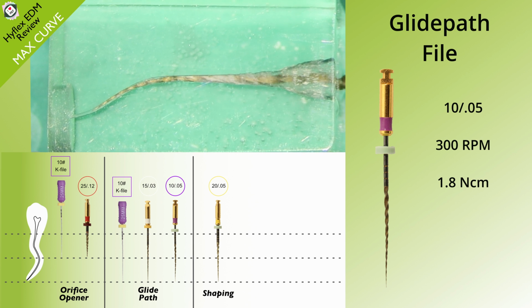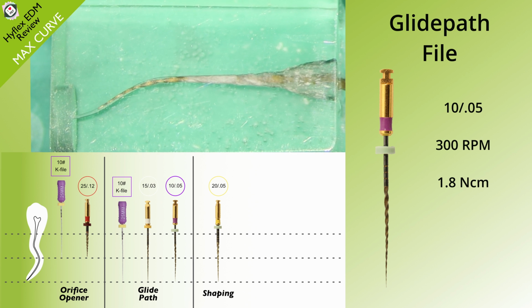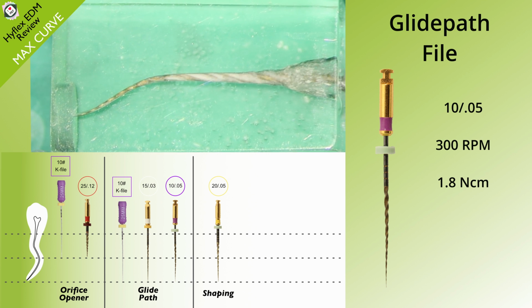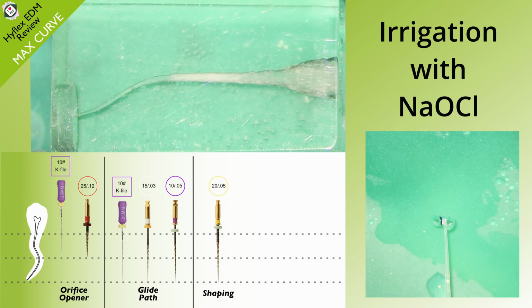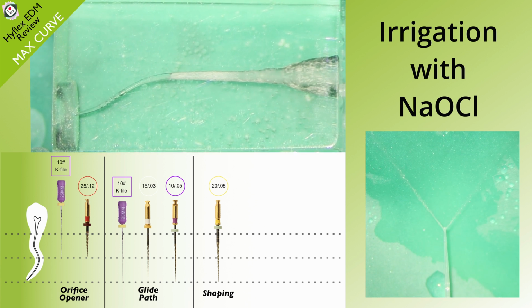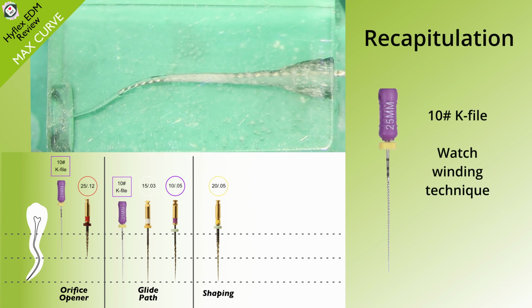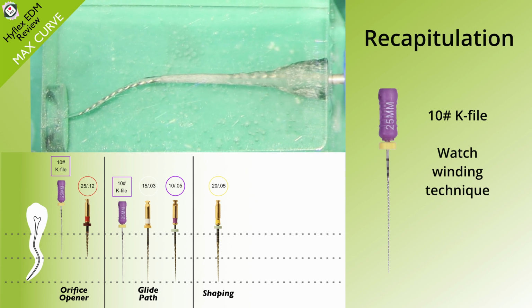And it works really well. And surprisingly, when you're using the size 15, it really goes to length really easily on real teeth. And you know, it goes against everything that you've been taught, but actually it works really well. Lots of irrigation, getting rid of all that debris. Recapitulation with a size 10K file. Make sure you keep that glide path open.